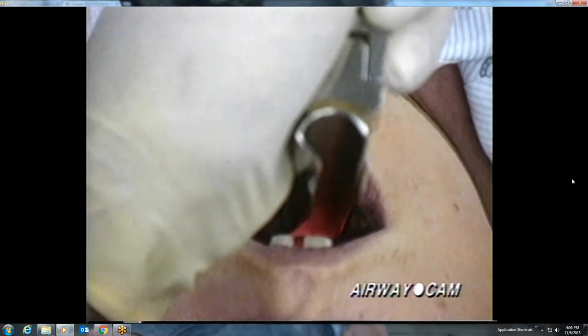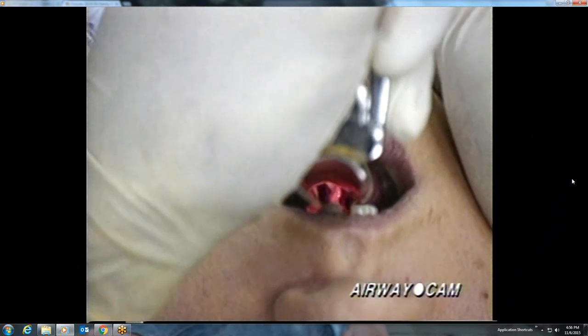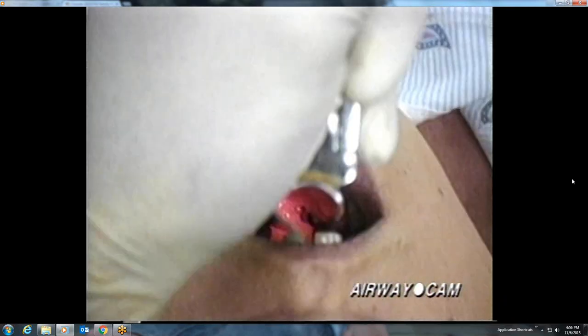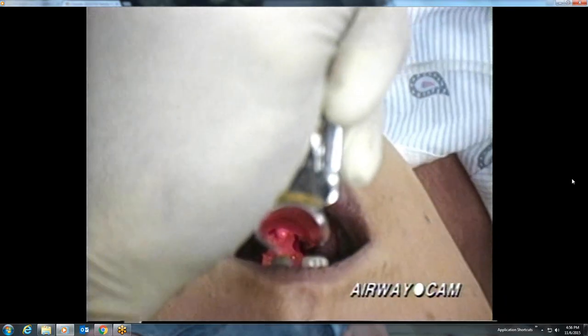The following two laryngoscopies show the importance of proper tongue control. The same blade is used on the same patient but with much different results. In the first case, the epiglottis is readily located and the initial view of the larynx is very good, including the posterior cartilages and the white of the true vocal cords. The epiglottis falls down repeatedly, however, and the laryngoscopist changes the angle of the blade and readvances in order to pick up the epiglottis.